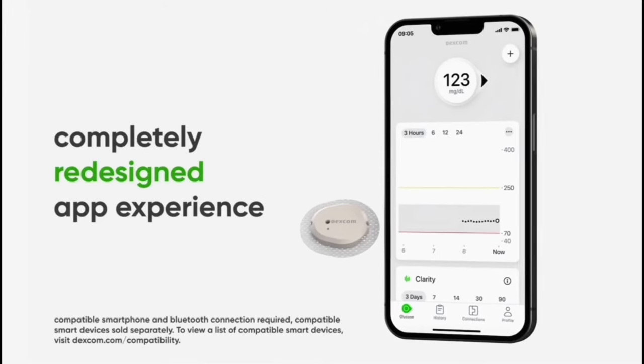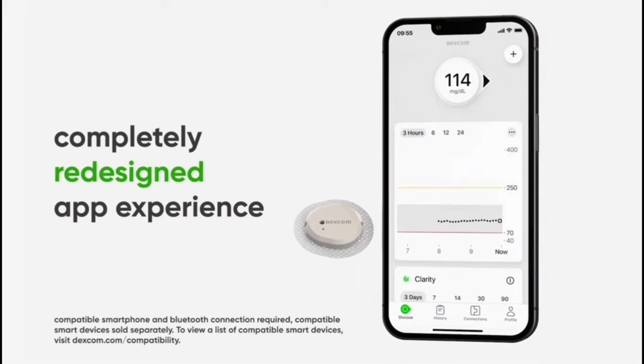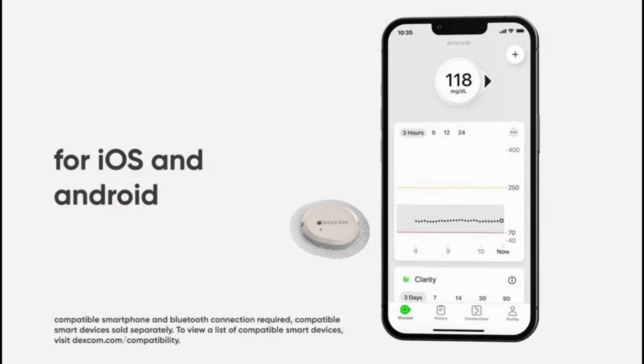So let's talk about the software side of things next — in particular, the new upgraded app for the Dexcom G7. The new app is completely redesigned for the G7. Outside of a much-needed facelift, much fancier graphics, and just overall being more aesthetically pleasing, there are also quite a few upgrades under the hood compared to the Dexcom G6.